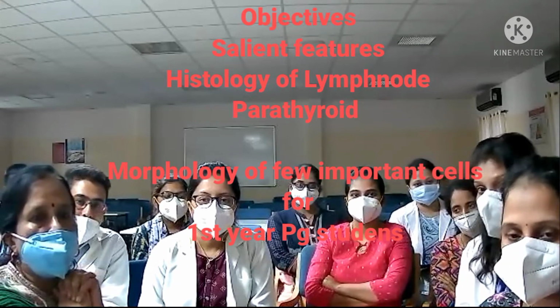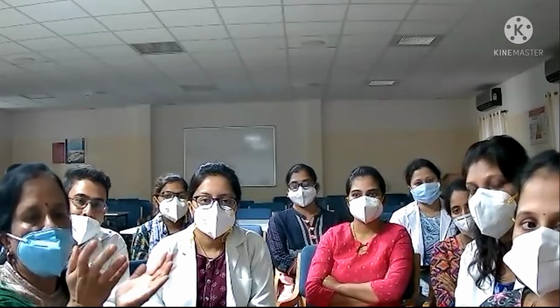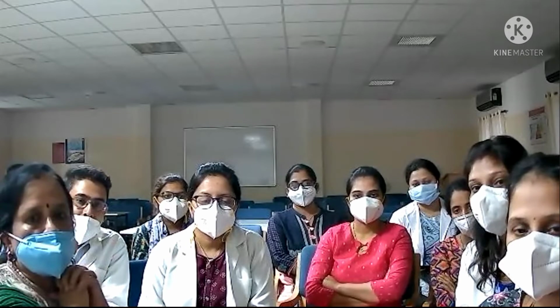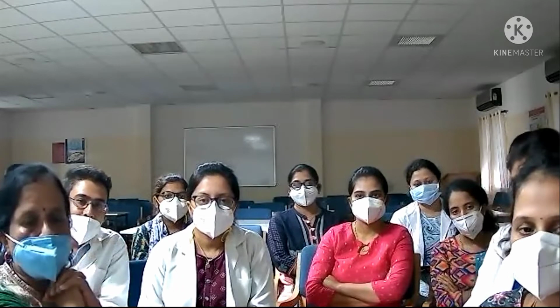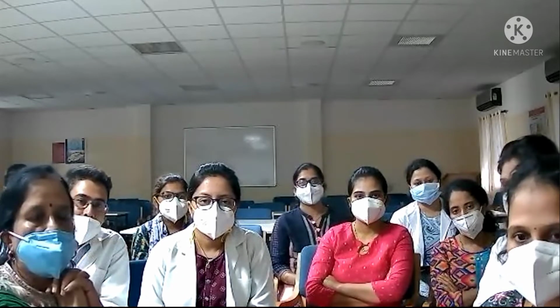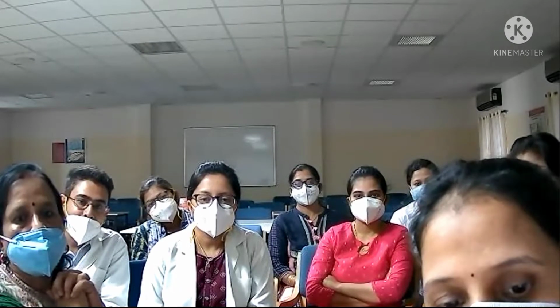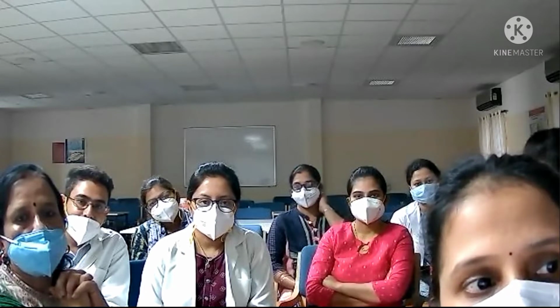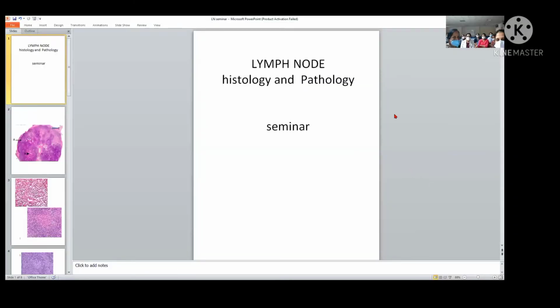So let us see how the PGs can identify the different structures, what she is asking them to. And let us learn mainly the microscopy here. Rajesh, you can start. So we'll just have the PowerPoint presentation. This is about the lymph node histology and pathology, mainly for the first year postgraduates. So she started sharing the screen.